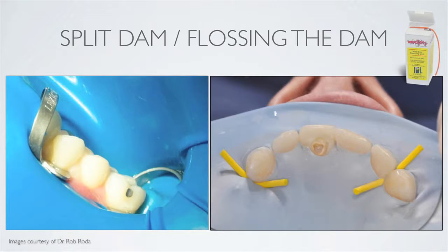You can also do something called a split dam technique. You don't even need to use a rubber dam retainer. But you can also use more than one rubber dam retainer. There's a lot of different creative ways you can use the rubber dam as long as you're isolating that tooth properly.